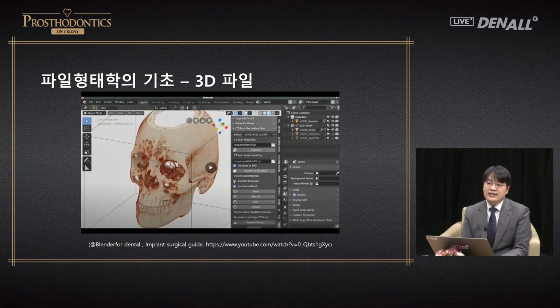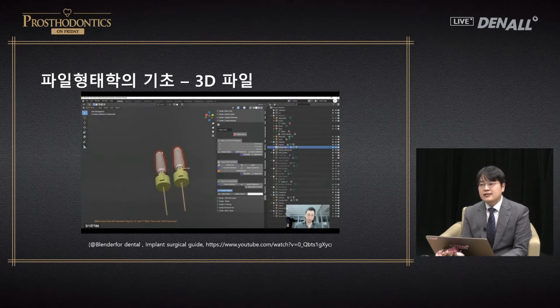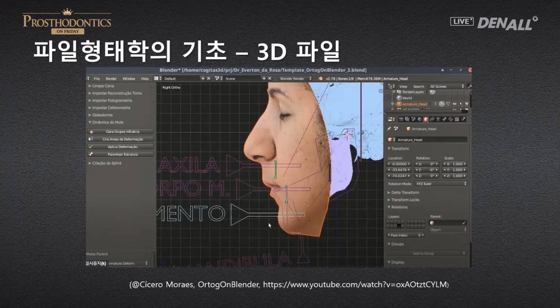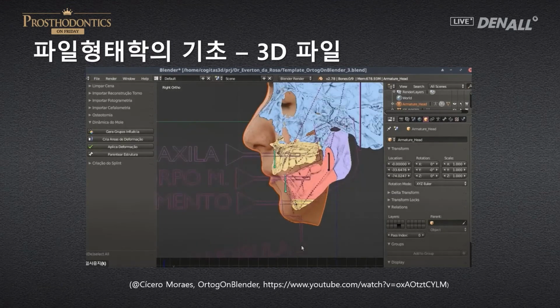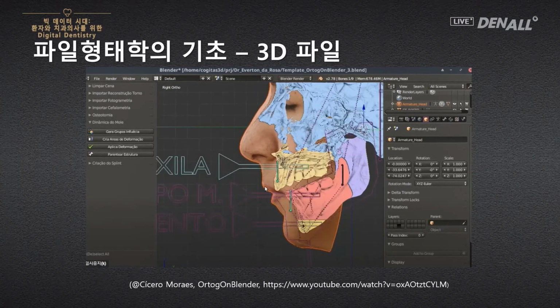An example of open source CAD: a Blender user opens the CT-DICOM file in Blender, acquires an STL file, and makes a surgical guide. With Blender, a crown, bridge, and inlay are included in there. If a vertex relation can be set, facial scan data and skeletal data can be combined to estimate the facial changes or outcome of jaw surgeries.